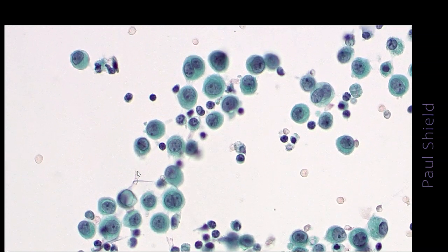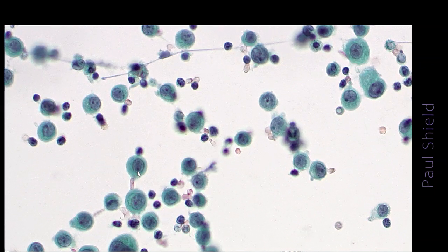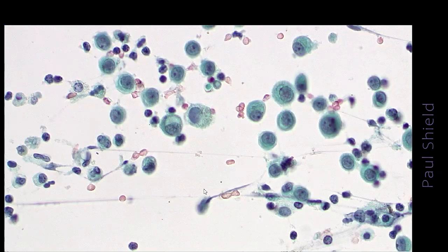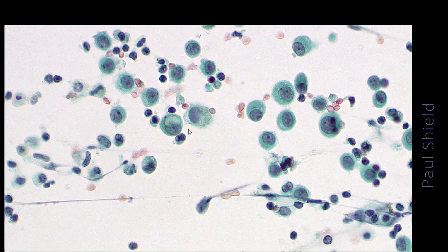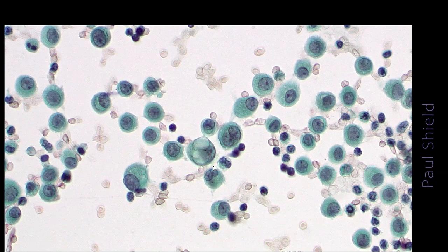There is a vacuole. It has like a hard edge to it, and that's quite a suspicious finding in view of all the other findings. So I'm very suspicious this is a single cell presentation of adenocarcinoma. Another nice hard edge vacuole there. You shouldn't see them in mesothelial cells, and this is typical of some types of lung, gastric and breast carcinoma especially. They will present. Here we've got a couple of big hard edge vacuoles in that cell there.